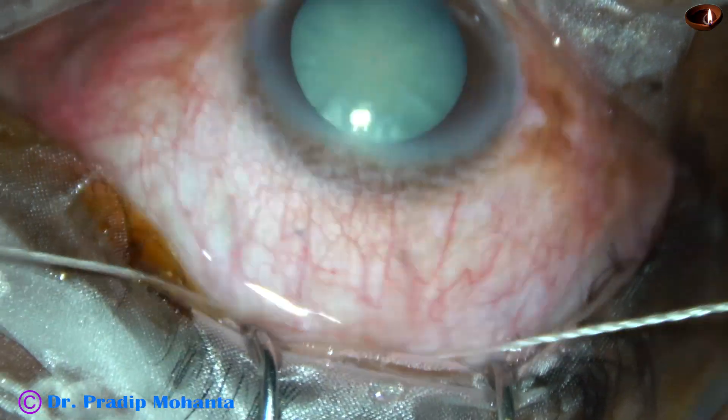This is the 2.8 mm entry. I take a cystitome, make a puncture, and raise a flap. We can see some fluid coming out, which indicates that there is positive intralenticular pressure. Intralenticular pressure is high.